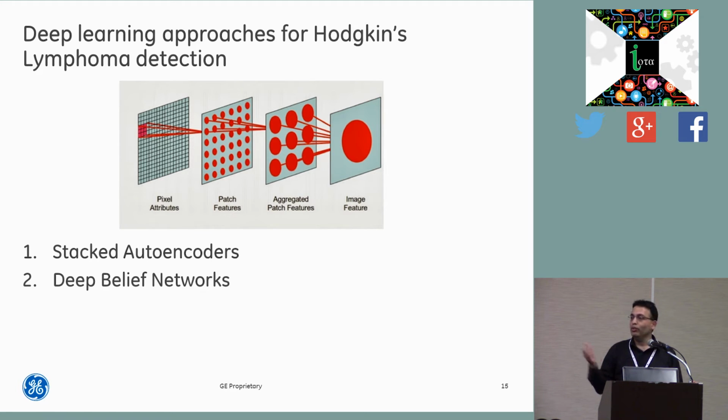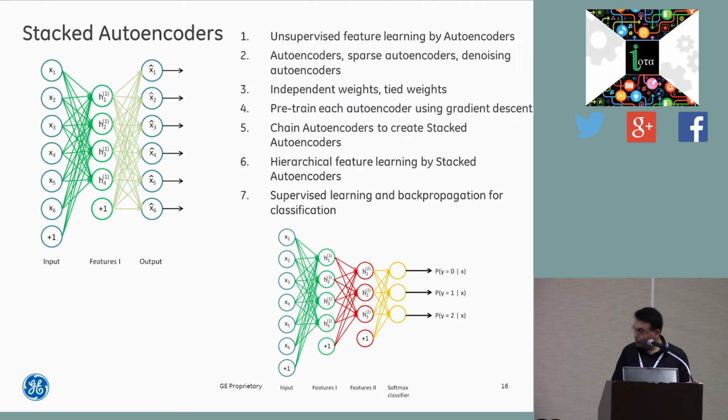Because with a false positive, maybe this network will detect a tumor cell, and pathologists would look at it and say, oh, no, that's not a tumor cell, that's okay. So it's a little bit of a waste of that person's time. But at least by not having any false negatives, we won't end up missing the opportunity of detecting cancer at an early stage. So that's how we fine-tune our internal networks.